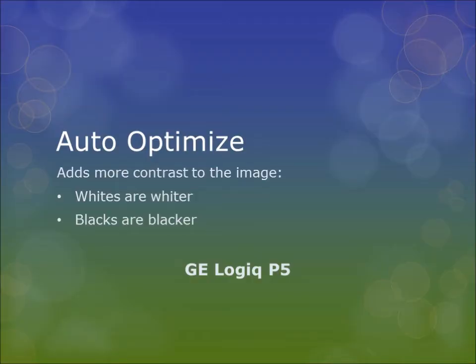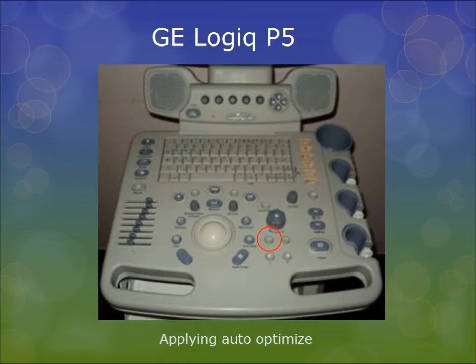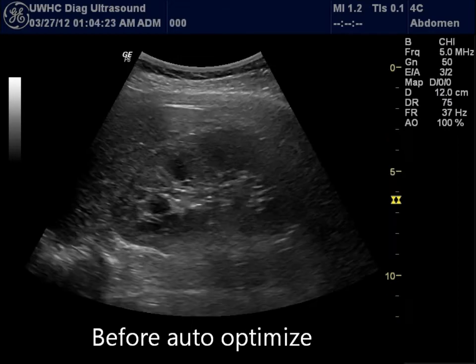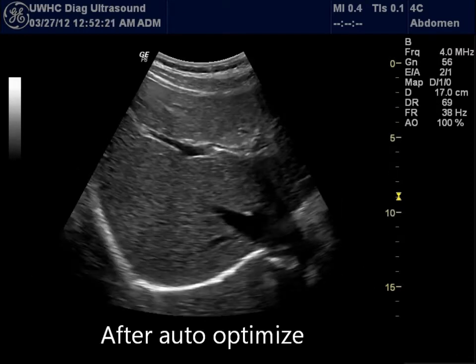Auto-optimize on the GE Logix P5 adds more contrast to the image — it makes the whites whiter and the blacks blacker. Before auto-optimize, notice the more fuzzy appearance of the liver and kidney. After auto-optimize is applied, one can instantly notice a sharper image with defined borders and interfaces.